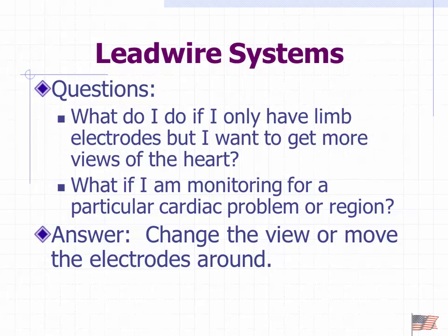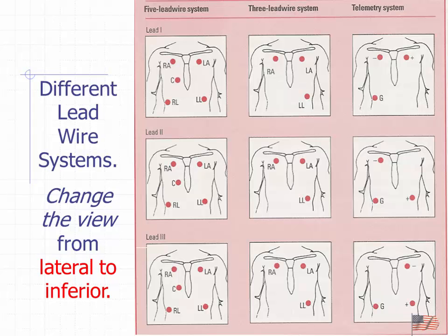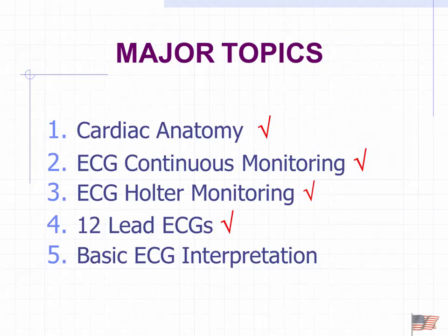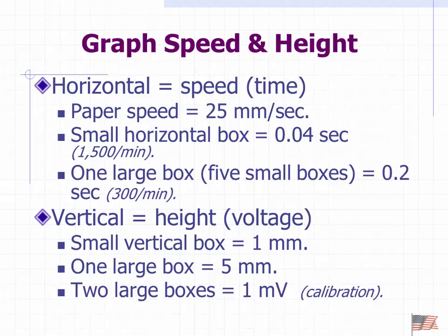We talked about this, just looking at different points along the line. So we can do different lead systems to get different pictures, as we talked about. Don't memorize, please. And the same thing is true with those modified chest leads.